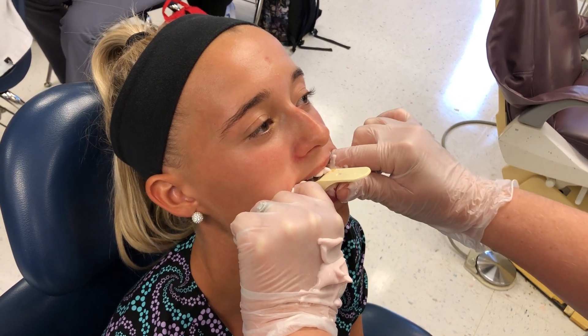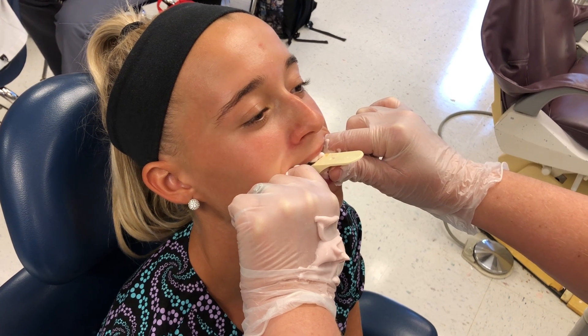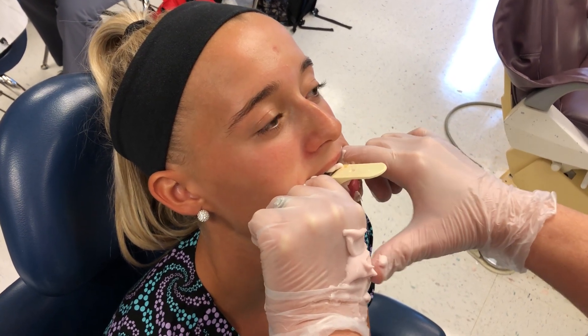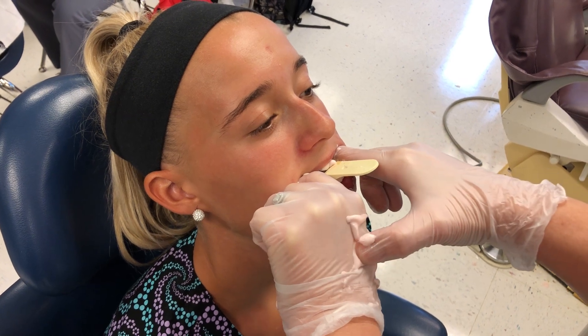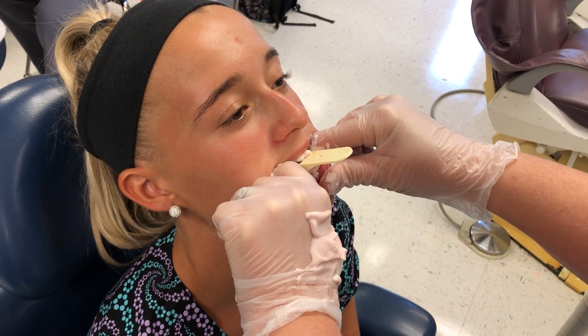Keep holding the lip. It's getting there — I'm pushing and it's still indenting, so it's not set up a hundred percent. You don't want to have any give.